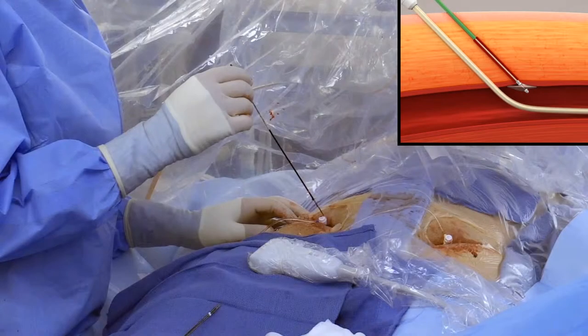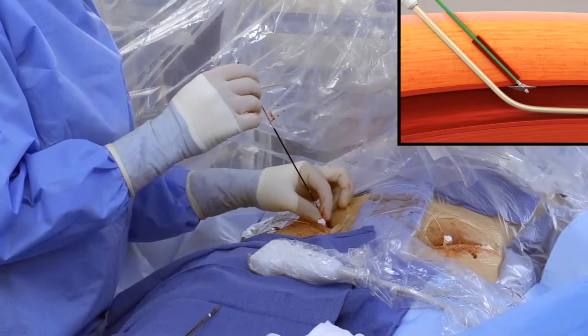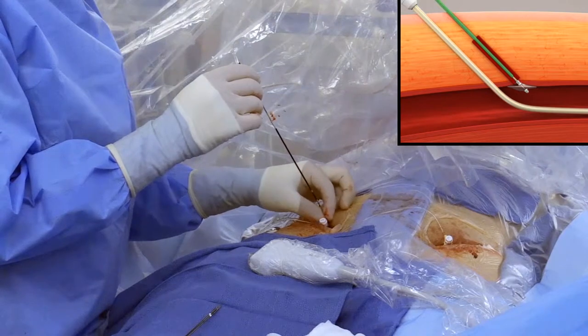Use the green tube to strip collagen while maintaining gentle tension on the device by advancing the green tube 1 and 1/2 centimeters down the tissue tract and then retracting it. Repeat 2 to 3 times to ensure collagen releases from the core wire. Upon completion of this step, leave the green tube in the forward position.